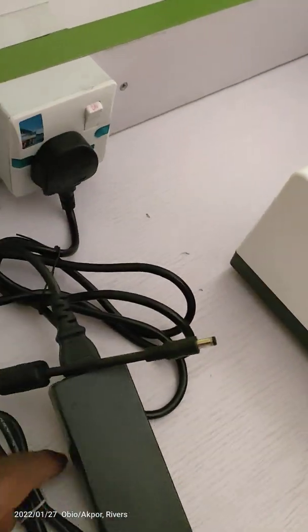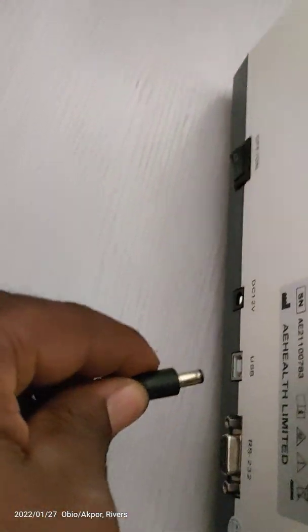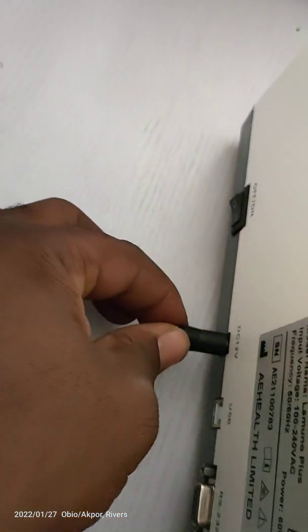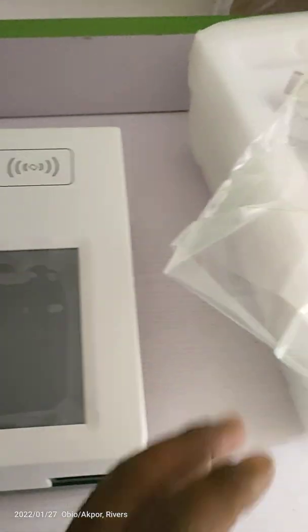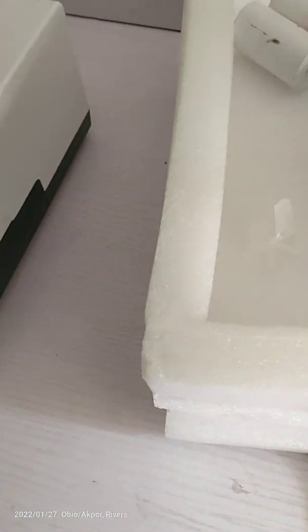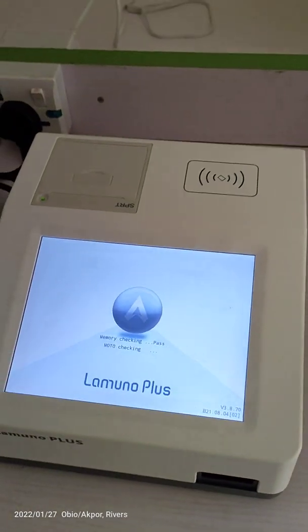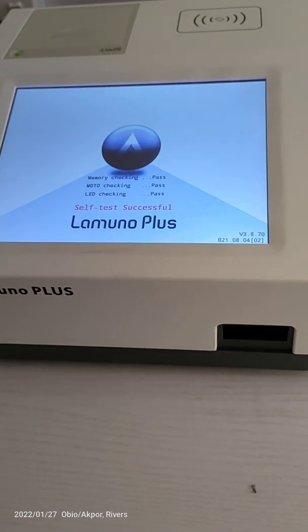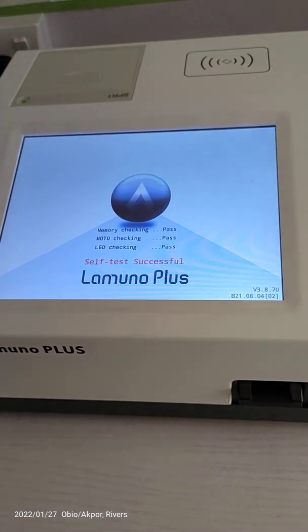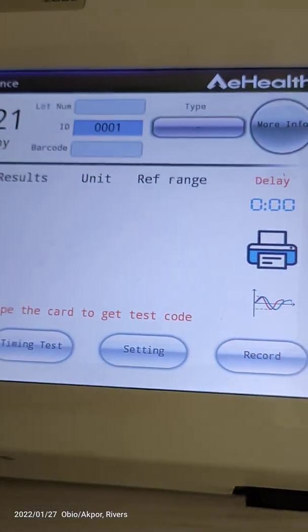I've connected the power cord to the adapter, and then the adapter at the back — you can see the power port. So now we can power the machine. The machine is powering on and doing a self-test. After the self-test the machine will come on by itself.